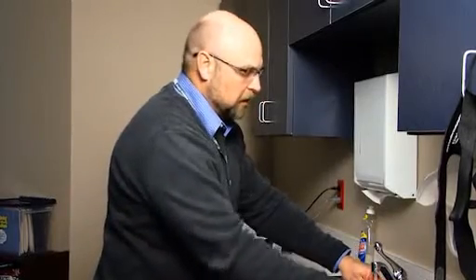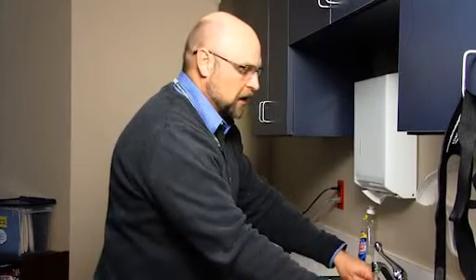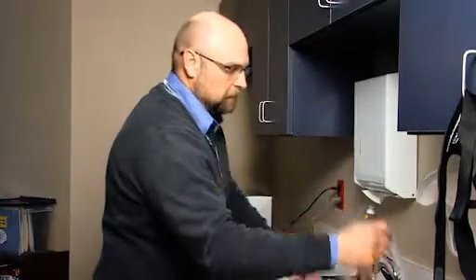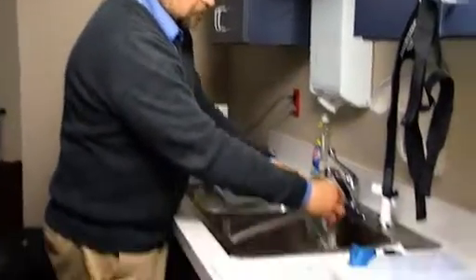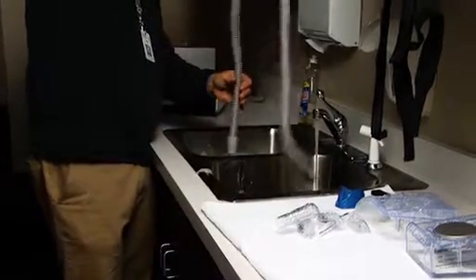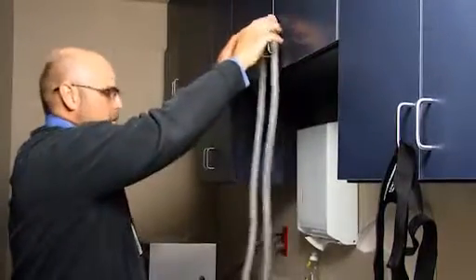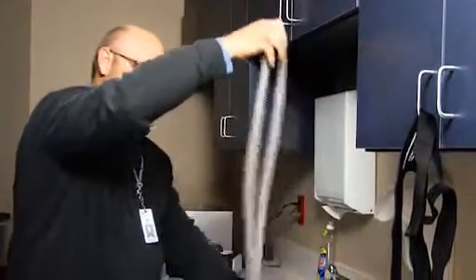The other thing too is that if you don't want to do any of this process, and we have a lot of people that are truckers and that kind of thing, you can get at the therapy shop some cleanser that's kind of a spray wash type of deal. It's made for CPAPs, and with this you just want to make sure that the hose gets all rinsed out, or like I say, you're going to start smelling. And this is just a hang to dry type of thing too. That's kind of the idea. And you want to do this weekly, and it dries out.